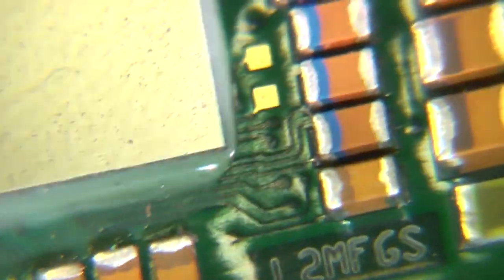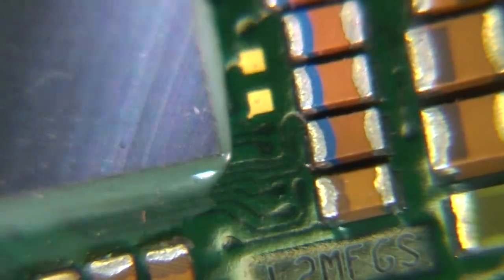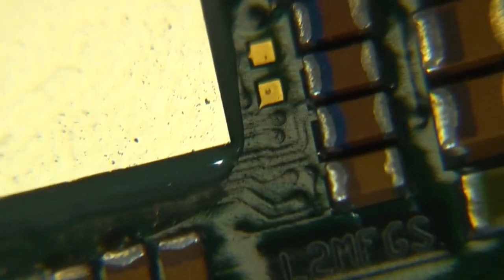You can see a few odd little bits of edges of layers poking out the side. And the vias seem to be buried vias as well. They don't go all the way through the board, they don't go up to the top. Very, very small. These may be laser drilled vias, they look extremely small.